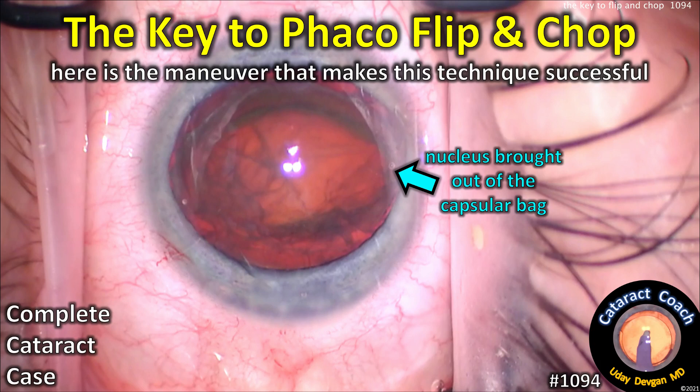CataractCoach.com — the key to phaco flip and chop. Here's the maneuver that makes this technique successful.